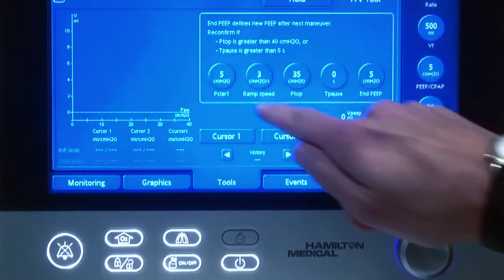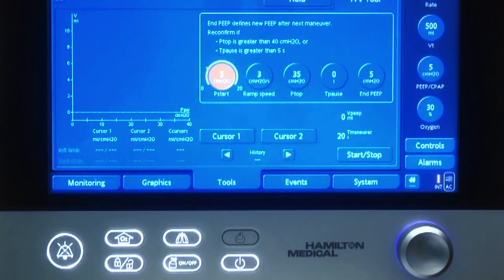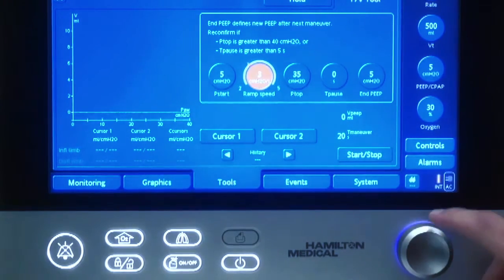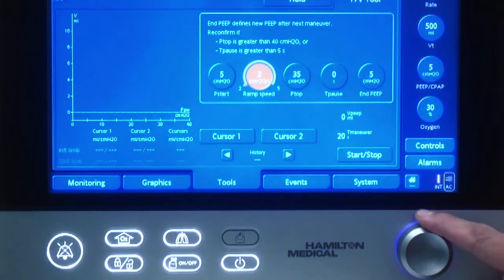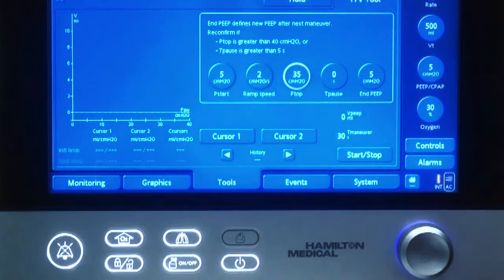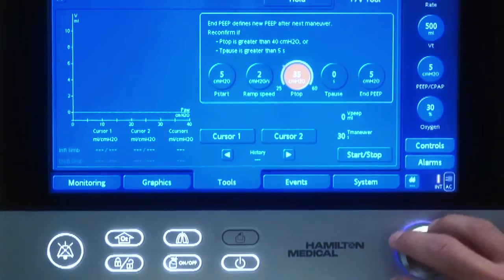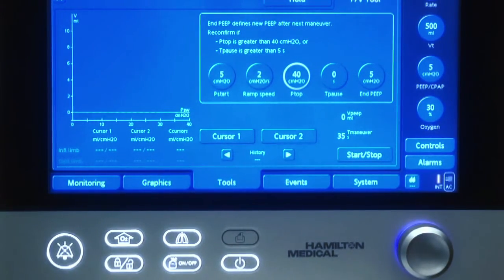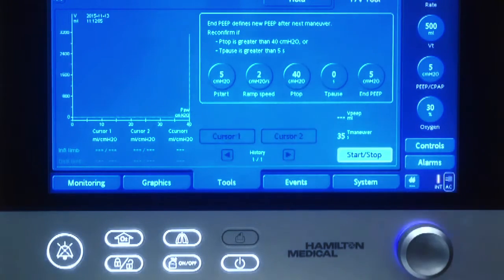First we set the pressure where we want the PV curve to start. Then we choose the ramp speed as low as possible. And then the Ptop, which we put to a level that we consider safe for the patient — 40 in this case. Then we can start.